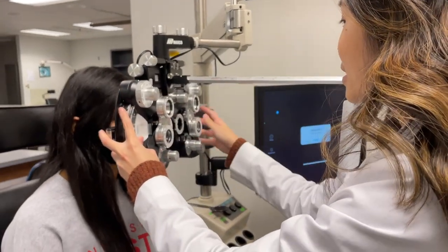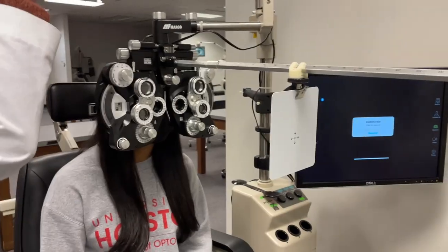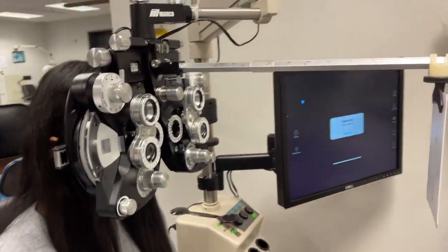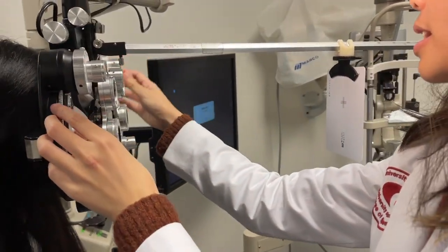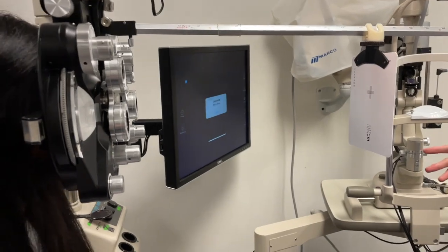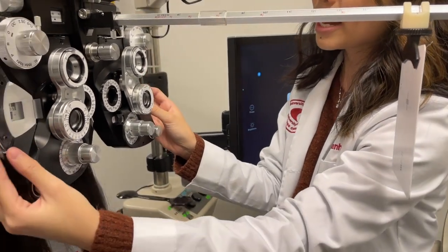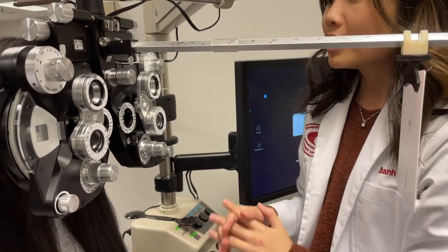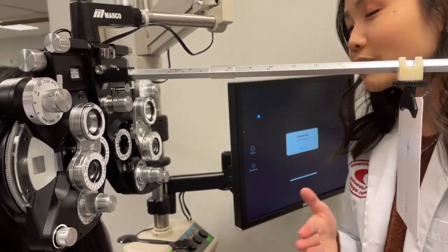All right, so I'm going to go ahead and have you come forward. And now I'm going to check to see how well you can focus up close. Okay, I'm going to put the light not directly onto the sheet of paper, but just slightly like this. Okay, I'm going to put in the aux lens and a plus one. All right, Mrs. Lee, you should see lines going up and down and then left and right. Is that correct? Yes. All right, which one's sharper right now? The vertical. And now? Still the vertical. And now? No, they're kind of the same. Okay, so that's going to be a lag of accommodation of 0.50, which is within normal limits. Mrs. Lee, your ability to focus up close is very good.